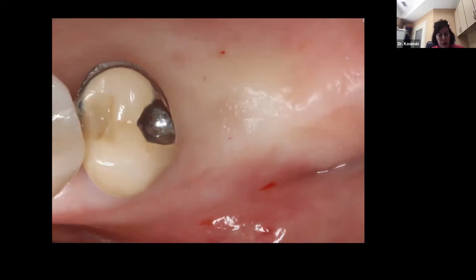An intraoral view of the edentulous space appears to provide adequate width for an implant and implant retained crown. Again, a CBCT analysis is an ideal tool to determine this fact. We can also determine available bone width by using a bone caliper. We must use anesthesia to the area before we use the caliper to make it comfortable for the patient. Height can only be guessed using a 2-dimensional radiograph, but we can precisely determine it using the CBCT.